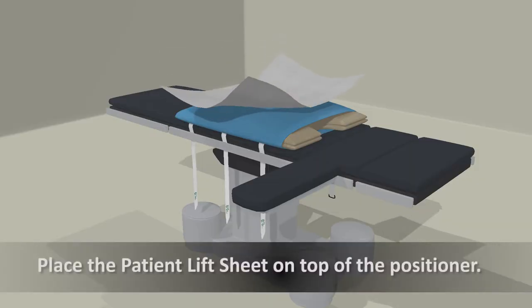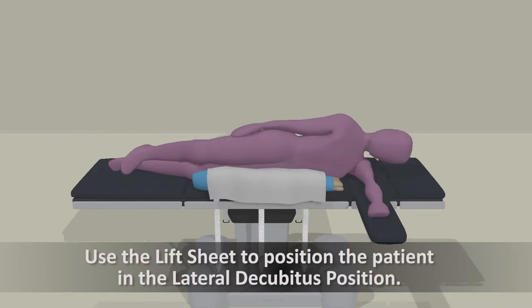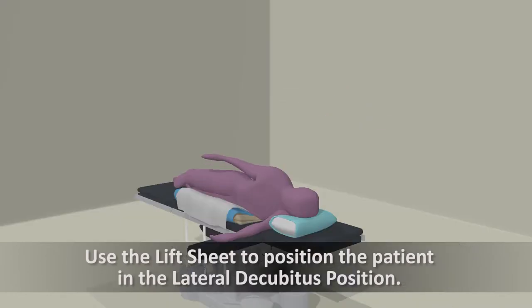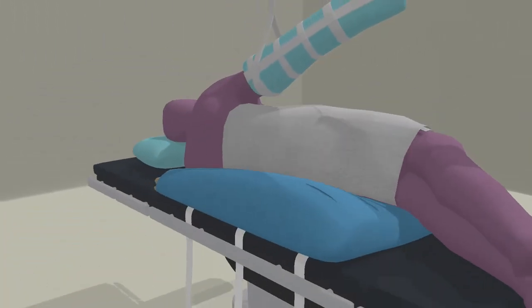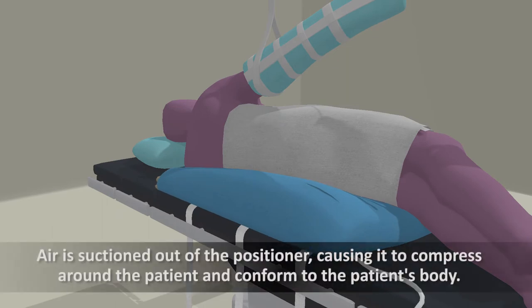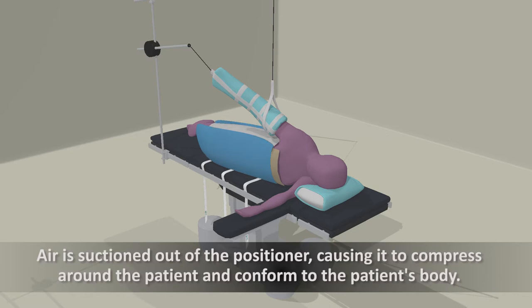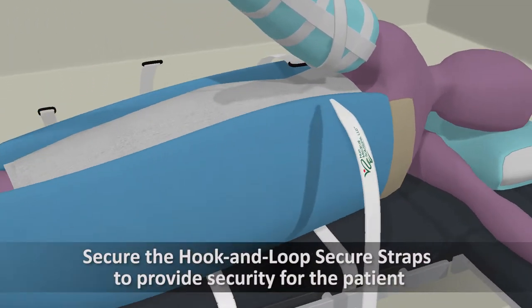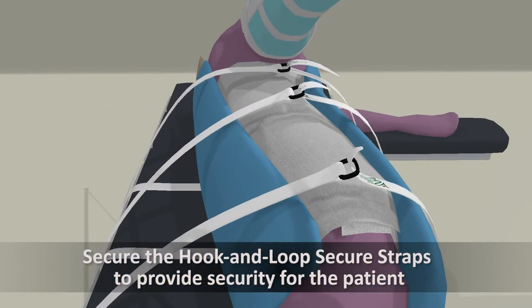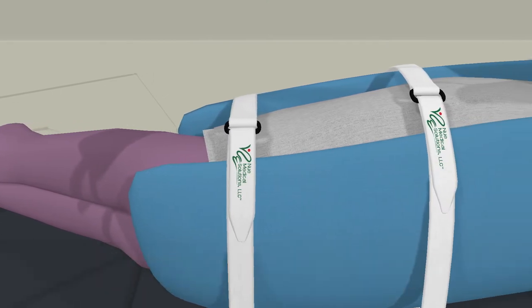Place the patient lift sheet on top of the positioner. Use the lift sheet to position the patient in the lateral decubitus position. Air is suctioned out of the beanbag positioner, causing it to compress around the patient and conform to the patient's body. Secure the hook and loop secure straps to provide security for the patient and to maintain the ideal position for the duration of the surgical procedure.